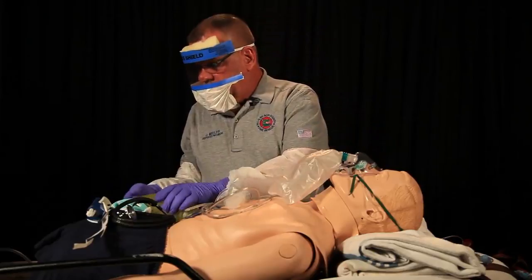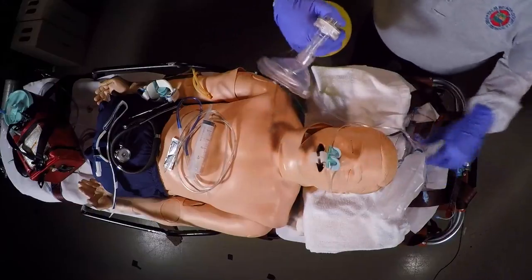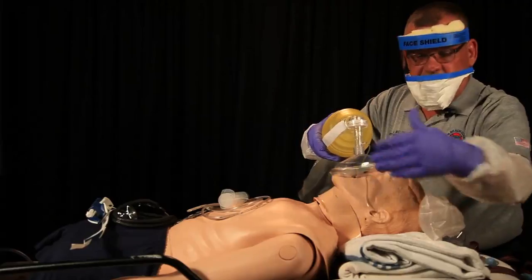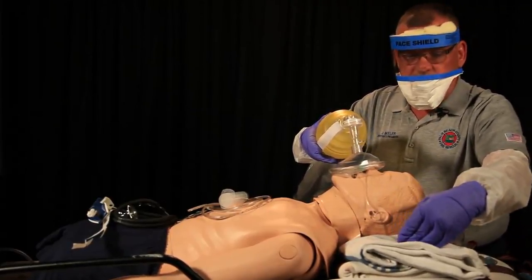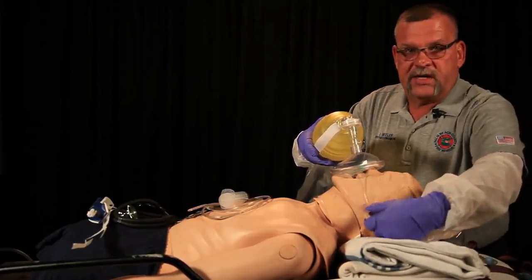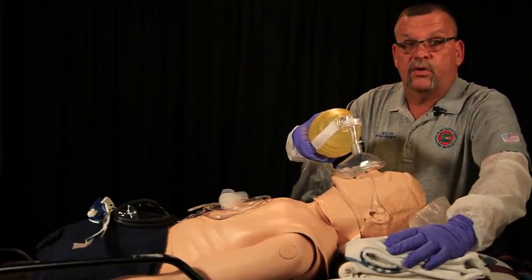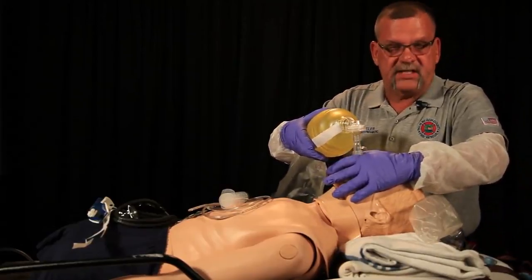What we want to do here is establish and make sure that the airway is patent, so we want to deliver two breaths via the ambu bag using good airway management technique, understanding that patient positioning is of utmost importance in managing this patient's airway. We want to make sure that the external auditory meatus, the ear hole, is in front of the sternal notch. We want to do that whether we're just using a bag valve mask device, OPAs, NPAs, or Kings or endotracheal tubes. We want to optimize this patient's positioning.